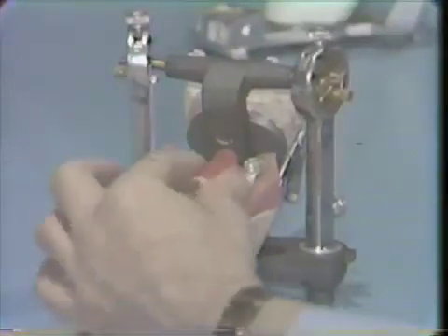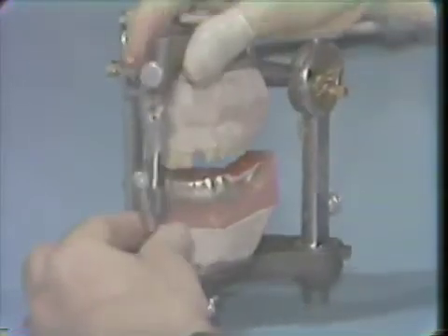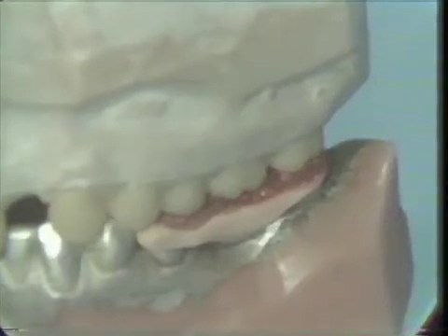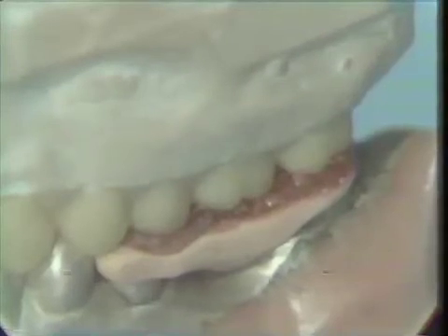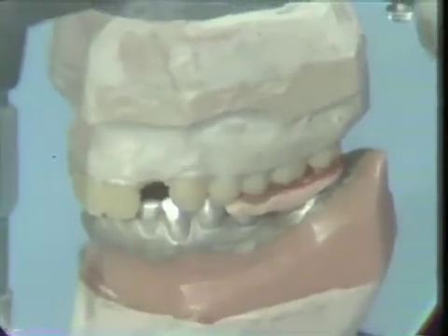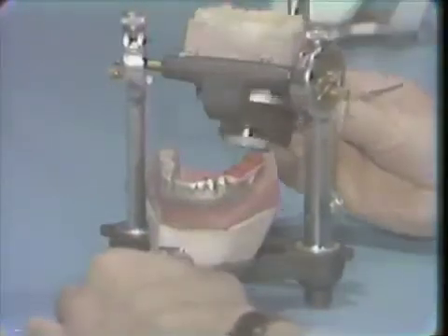We'll place our platform onto our fabricated dies and close the anatomic cast into the wax. And you can see that if we did not have the stop areas in acrylic, we would distort the wax. We would now utilize our shim stock to check our key teeth to be sure that we still have the proper relationships, and we would box around the platform and pour our stone core.